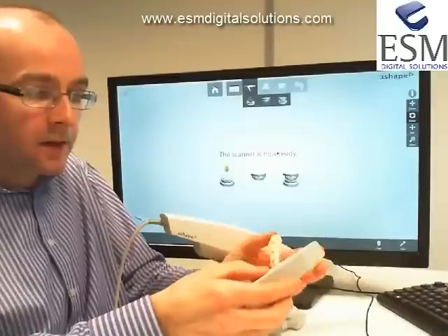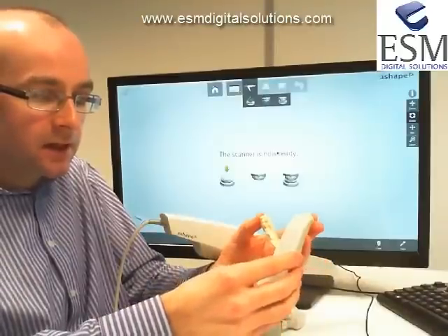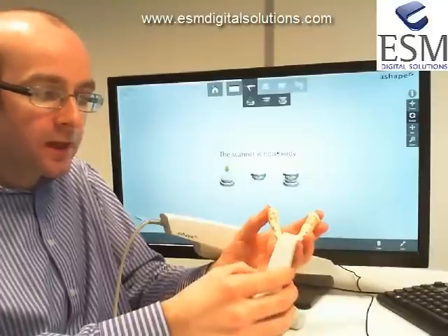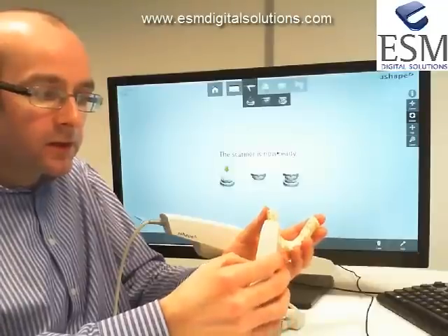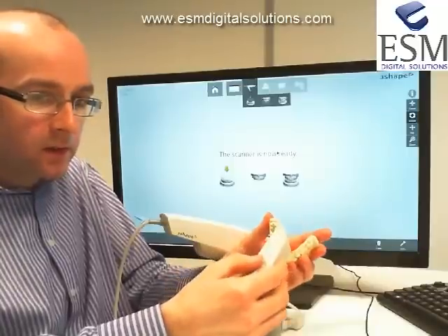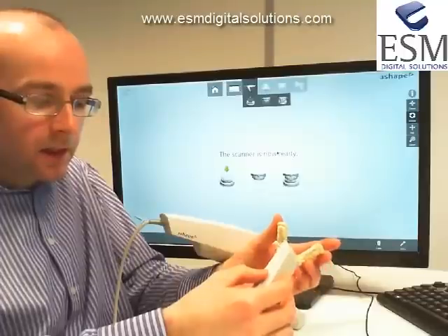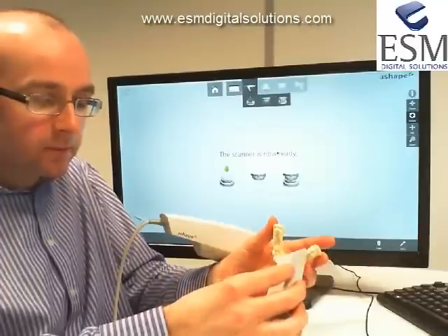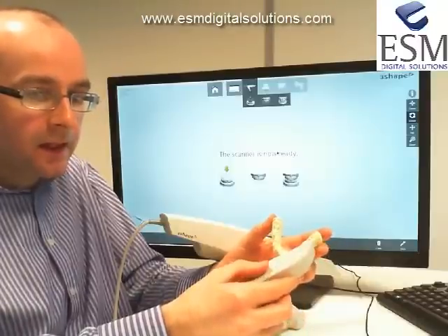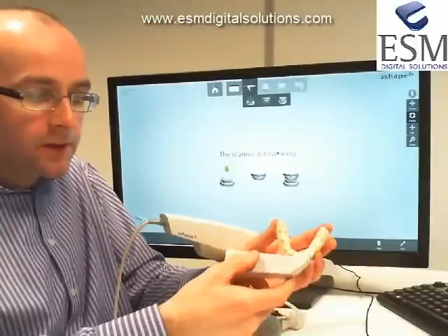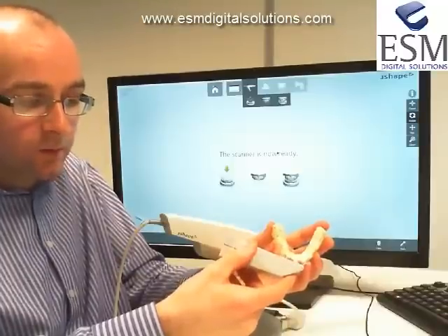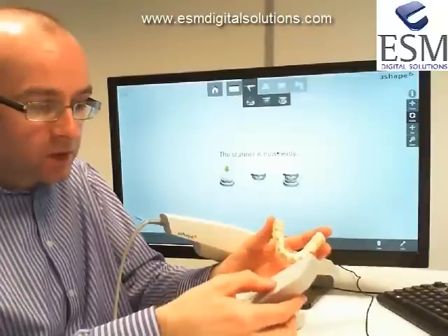The standard scan process starts at the posterior region on one side - either right or left, it doesn't really matter. We try to capture the occlusal surface in one sweep. Once we've done that, we're free to rotate over and scan lingually or palatally. Then we roll over and scan the buccal side as well, sweeping around the anterior region. If we can't continue in a particular flow, we can pull away - we can stop the scanner if we wish, we don't have to.